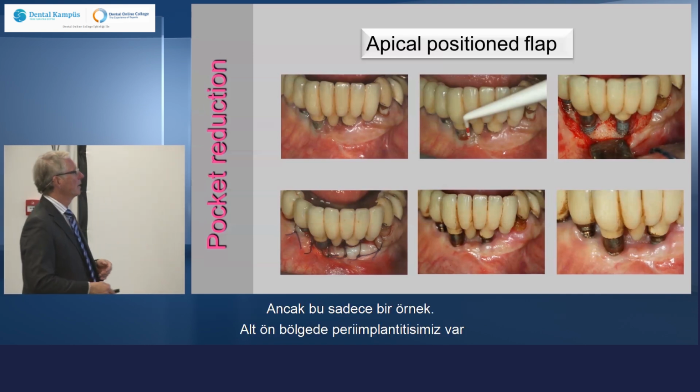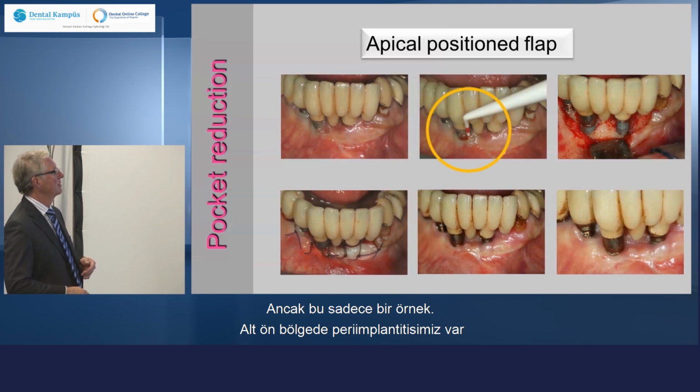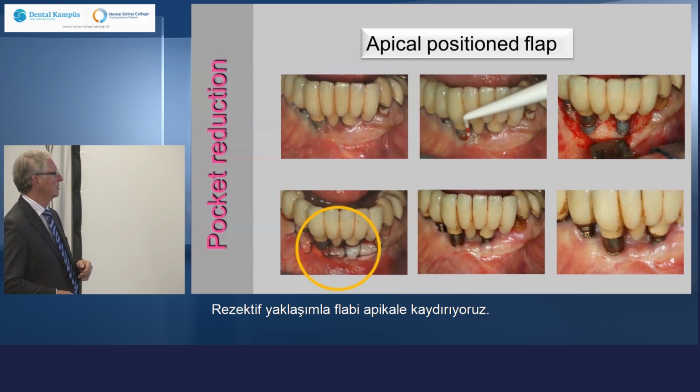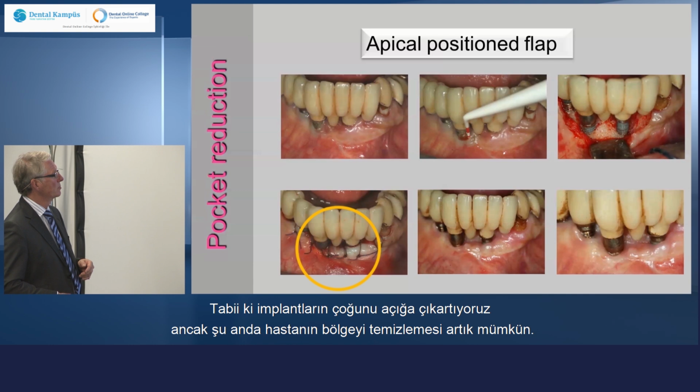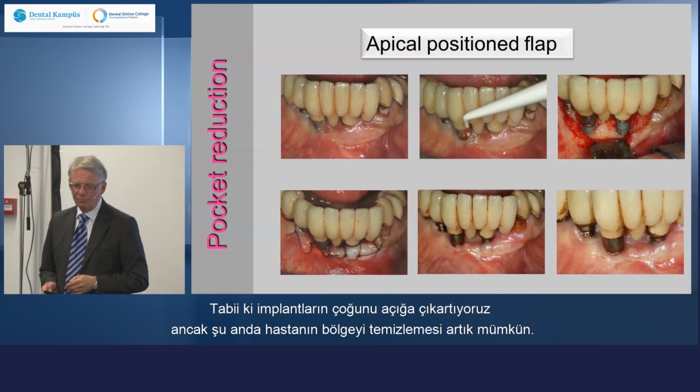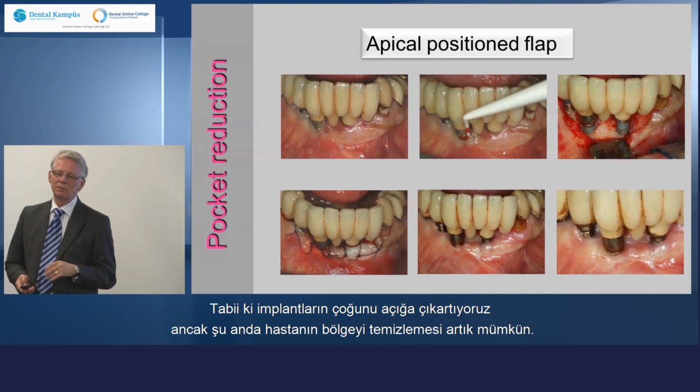But this is just an example. We have peri-implantitis in the lower front area. We do a resective approach, apically position the flap, and of course we will expose much more of the implants, but it is now possible for the patient to clean the area.